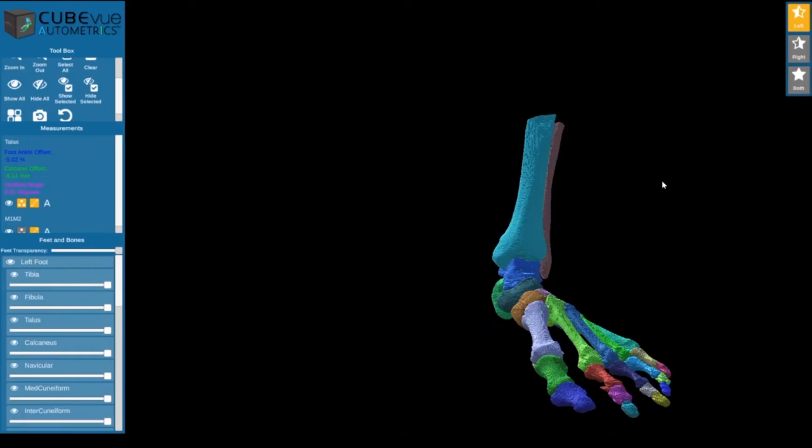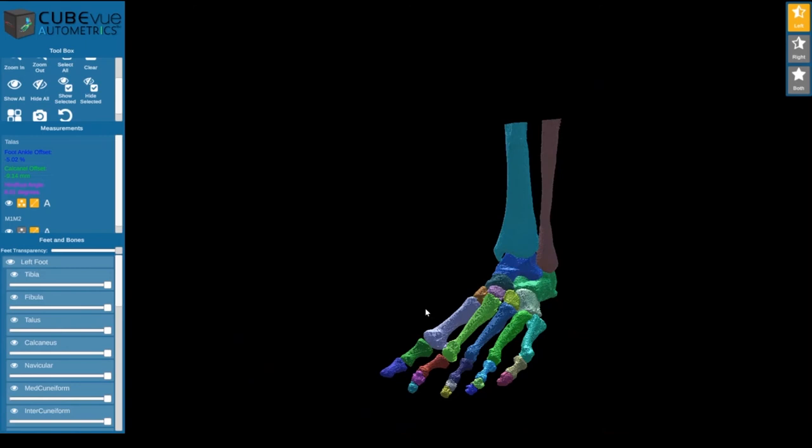With our CubeVue Autometrics website, you'll be able to upload your scans to the cloud and they will be automatically processed and segmented. Then you can view the results from any device with an internet browser.